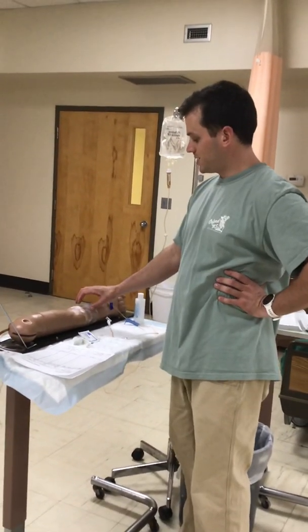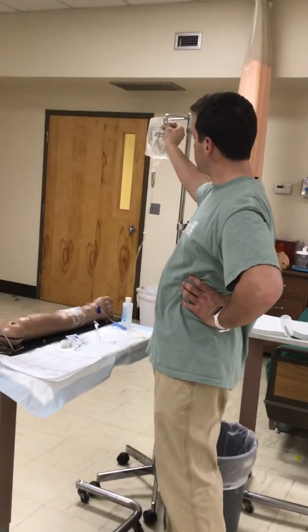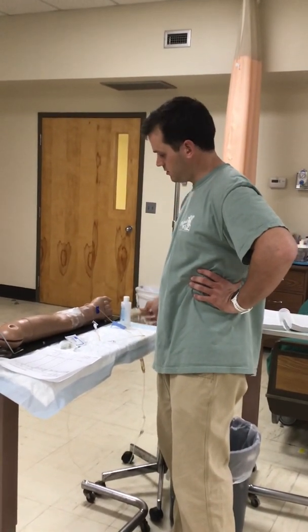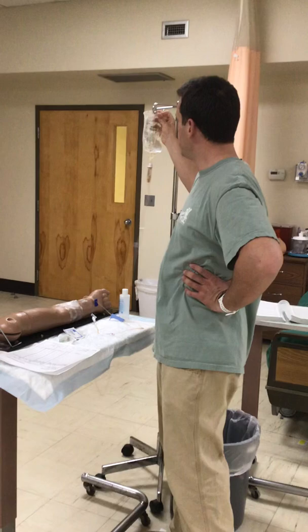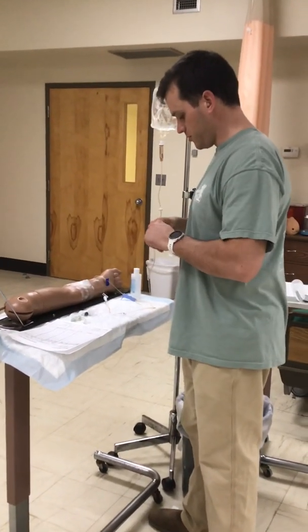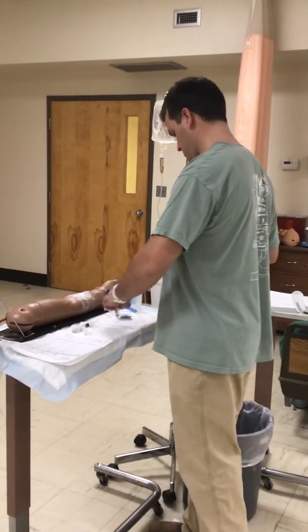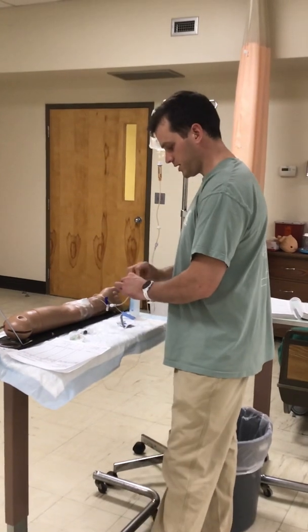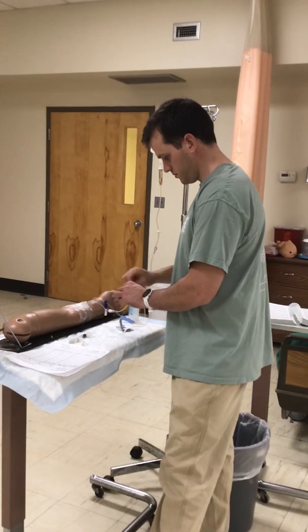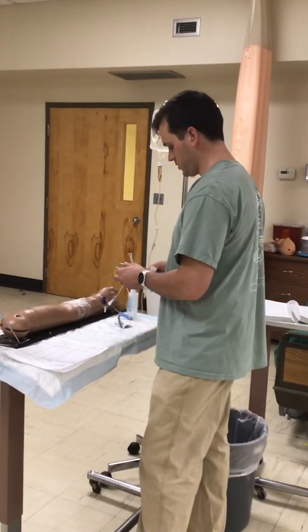I'm going to assess the site, make sure there's no redness, edema, or swelling. Check for patency by lowering the primary IV below the site. Check for blood return. It is patent. At this time, I'm going to go ahead and scrub the hub for 15 seconds. I've done that.